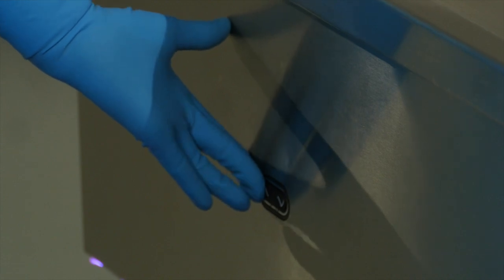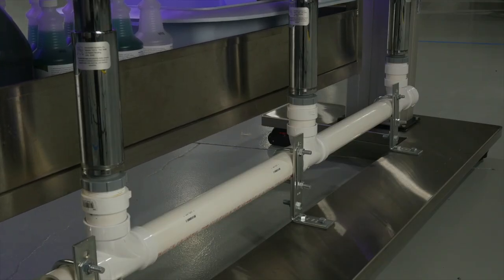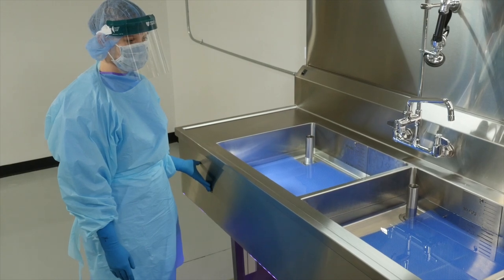The sink's height adjustability meets OSHA ergonomic guidelines by easily raising and lowering the working levels for technicians, so they can perform at their best at a comfortable level while reducing repetitive task injury and fatigue.